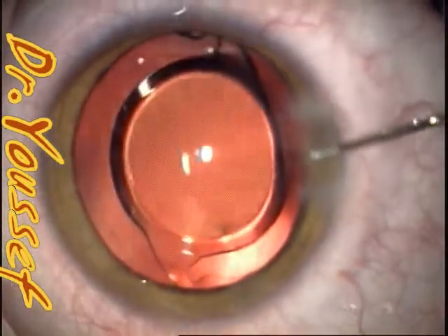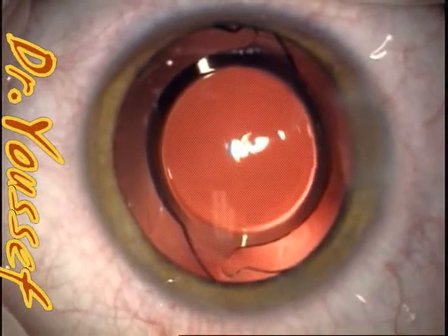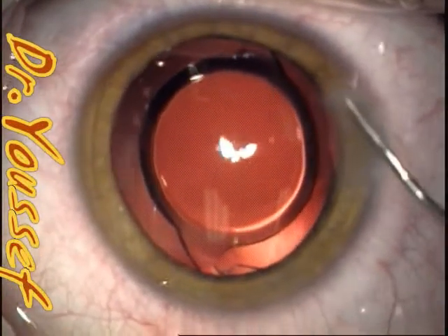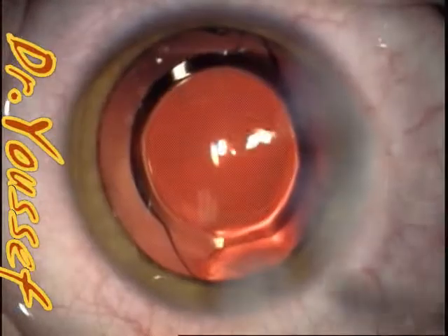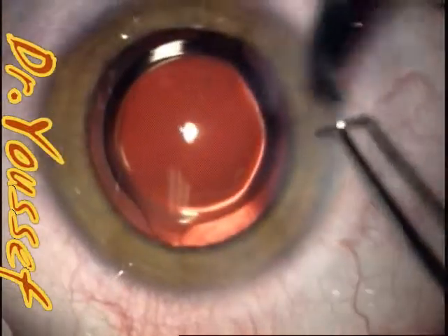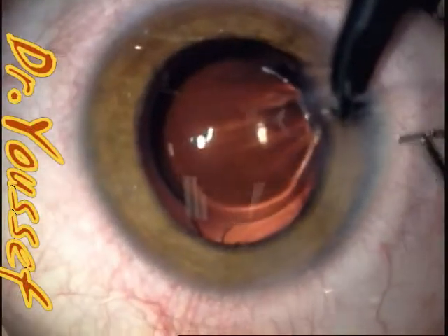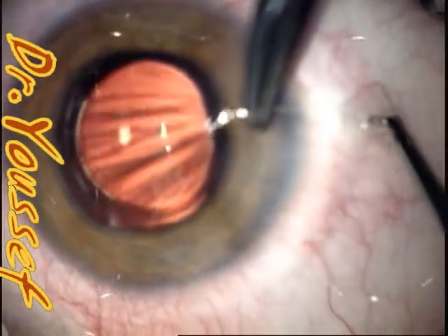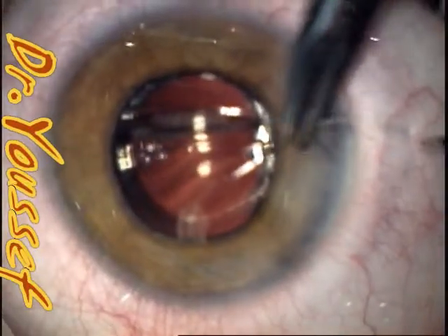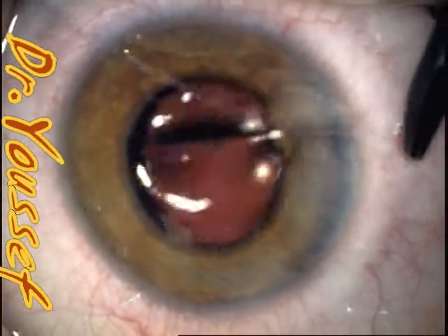After the J cannula, another important consideration with kids is that they have low scleral rigidity, so the eye tends to collapse easily. I'm hydrating the wounds and using Avalox to guard against infection and to hydrate and seal the wound. For this age, we usually put an absorbable fine suture — like 9-0 or 10-0 vicryl — because we can't remove it later. The suture is placed because kids are active, they can rub their eyes, so we have to make sure the eye is well sealed.